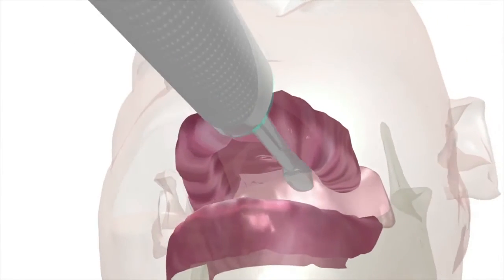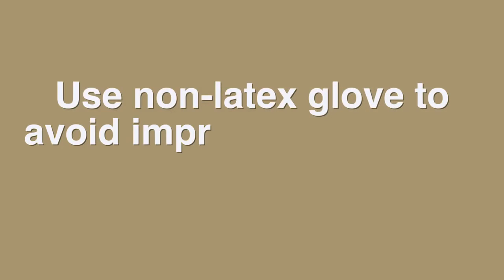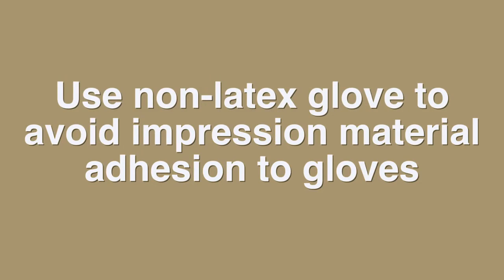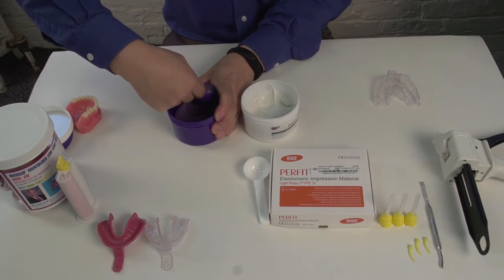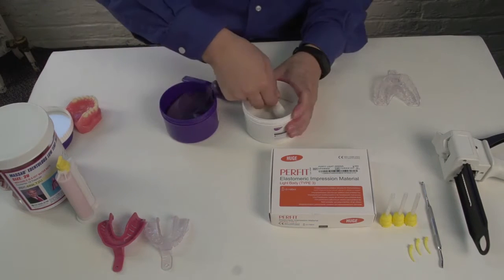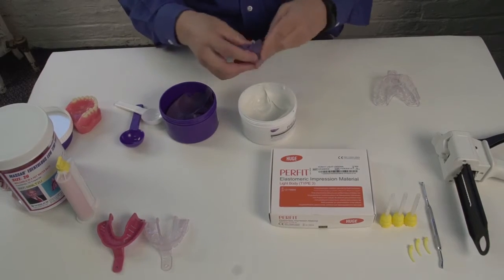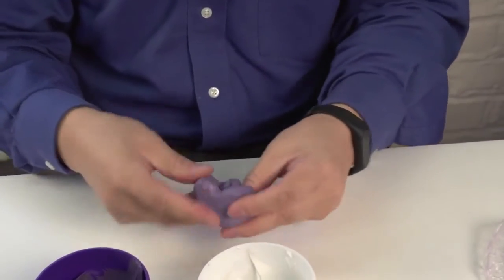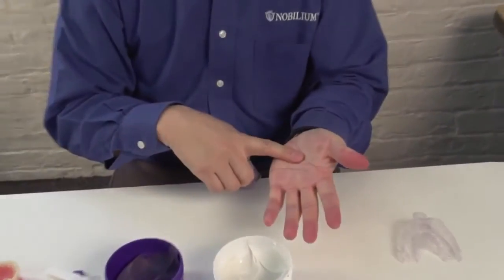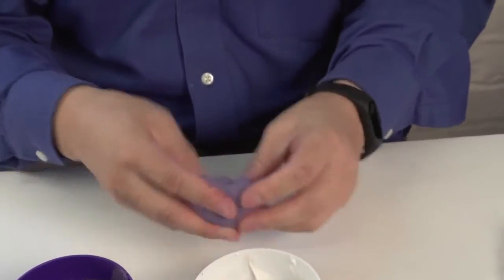The patient should rinse their mouth several times before the impression procedure. The clinician should use non-latex gloves to avoid impression material adhesion to gloves. Using the Perfit putty, scoop the base and catalyst in equal proportions with measuring spoons. Use fingertips to thoroughly blend the materials for at least 30 seconds until the mixture becomes well blended without color streaks. Avoid using the center of the palms, as the higher temperature will shorten the setting time.